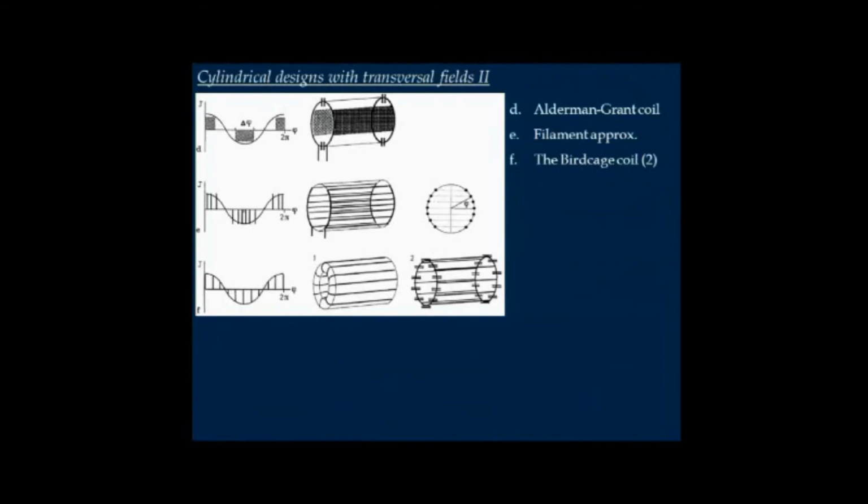An approximation of that is the filament coil type, where you have different spacings between the filaments. So at 0 and 180 degrees, you have large gaps between, which get closer, coming to the area of maximum desired current densities. And if you project those, then they would be equidistant. So that's the way you space them. You can drive that as far as you like. So the approximation is arbitrarily close. The more filaments you take, the closer you get.